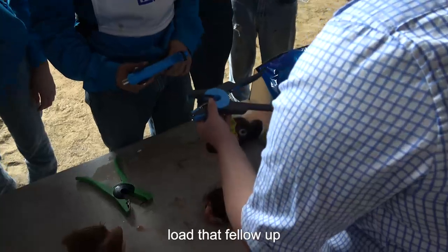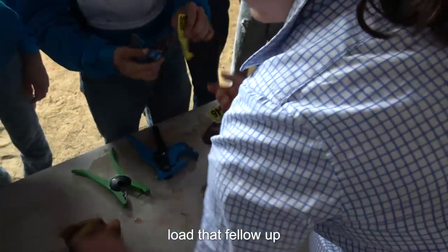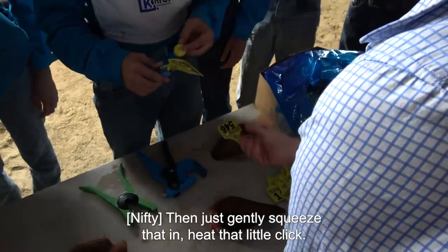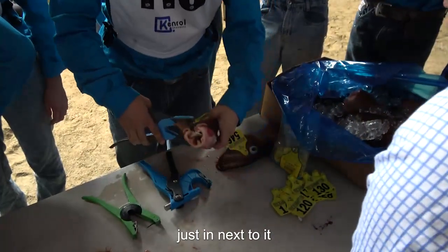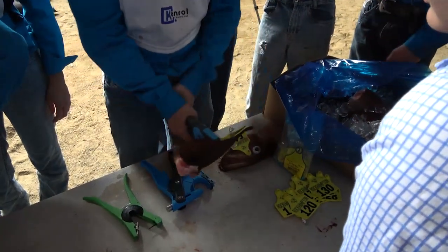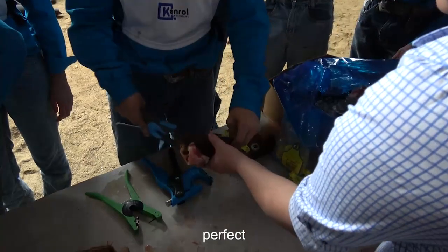All right, load that one up. Just make sure it's right. Then just gently squeeze that in. You hear that little click? Show the red thing. Ready to go. Perfect.